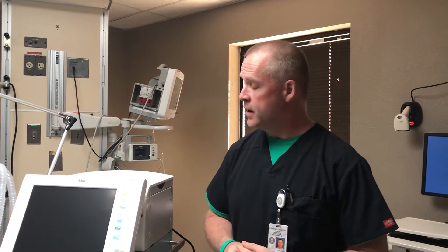Good morning, good afternoon, good evening, depending on what time you see this video. My name's Richard. I'm the Cardiopulmonary Manager here for Cherokee Nation Hastings Hospital. I'll give you a quick overview of the Draeger XL ventilators that we have.